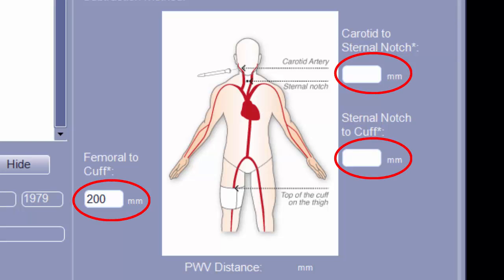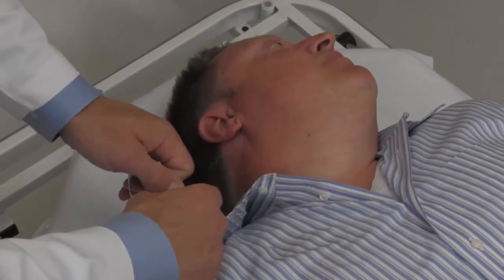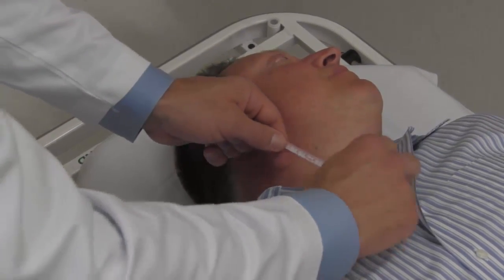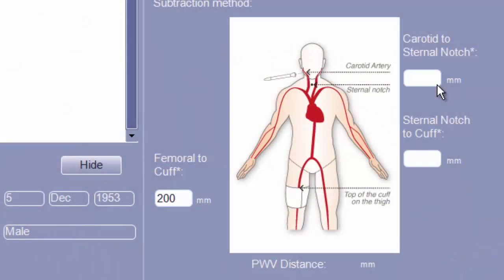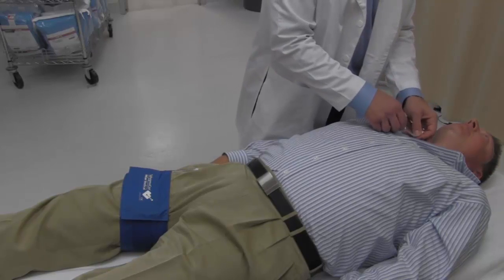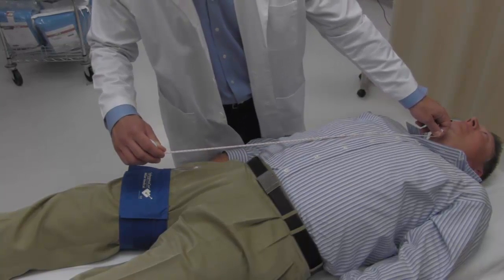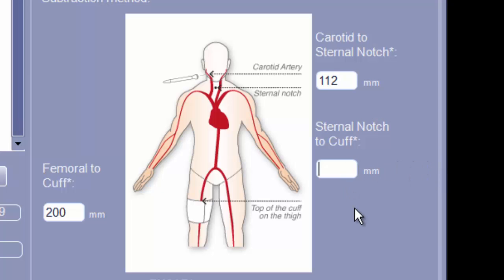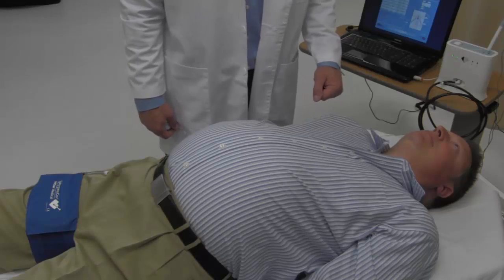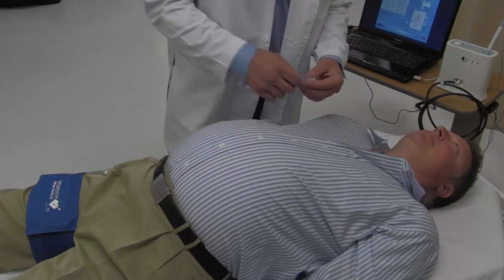All distances should be measured and entered into the software in millimeters. First, identify the suprasternal notch — it is located in the midline of the body at the top edge of the sternum bone. Measure the distance in a straight line from the suprasternal notch to the point of the carotid pulse previously marked, and enter this into the carotid to sternal notch field. Next, take a second measurement from the suprasternal notch to the top edge of the thigh cuff. Enter this into the sternal notch to cuff field. It is important to not measure along the contour of the patient's body, as doing so will result in an inaccurately calculated pulse wave velocity.